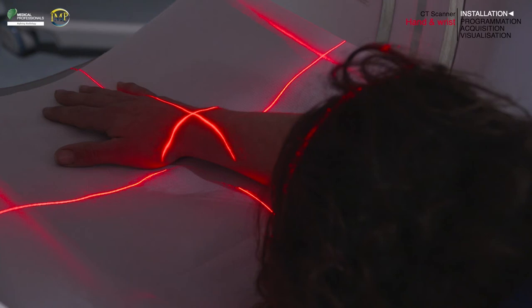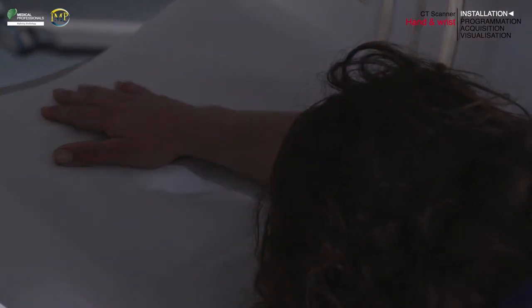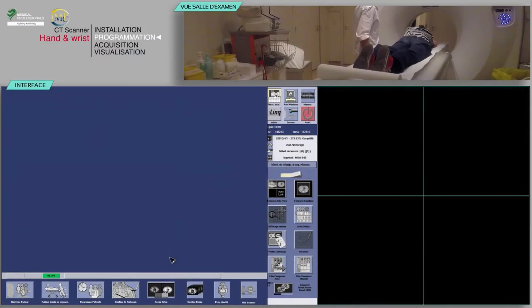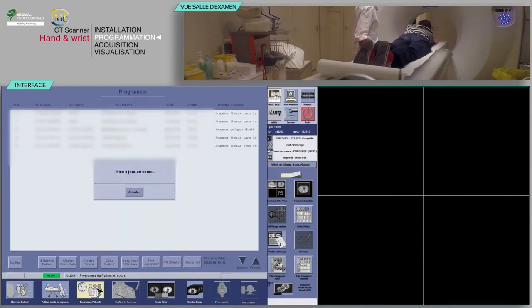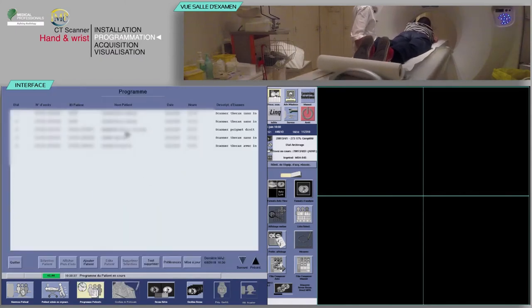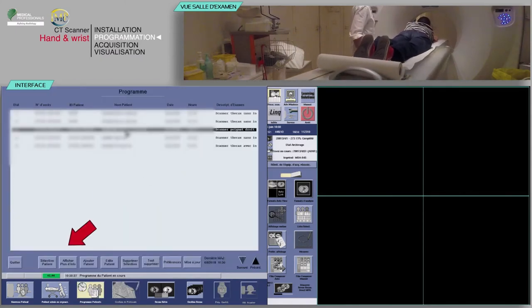Remember to close the doors of the examination room and perform proper hand hygiene such as the use of a rub with an alcohol-based hand sanitizer. Select your patient from the work list, then click on patient selection.